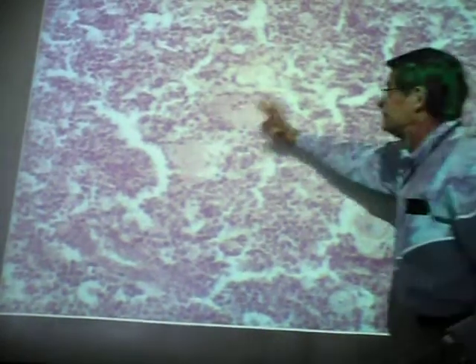And then something very distinctive, found only in the thymus, and it's in the medulla of the thymus. You can see them scattered around here. What are these? You call them thymic corpuscles or Hassall's corpuscles. What is their function? Don't say function unknown. That's what your photo atlas says, but they now know there is a function.